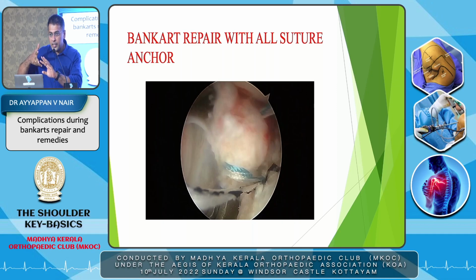My first bite would be a mattress. That means one pass, then the second pass, which should be quite deep in the IGHL. I find the scorpion good because the profile of the scorpion is much smaller compared to the first passes and all that. So this goes quite deep inside, and the bite is around 1.5 centimeter in. That is a very nice plication. And if I do a mattress there, the first is a mattress. You can see this mattress coming in now.